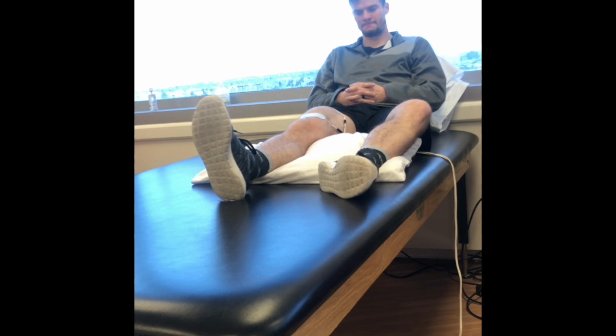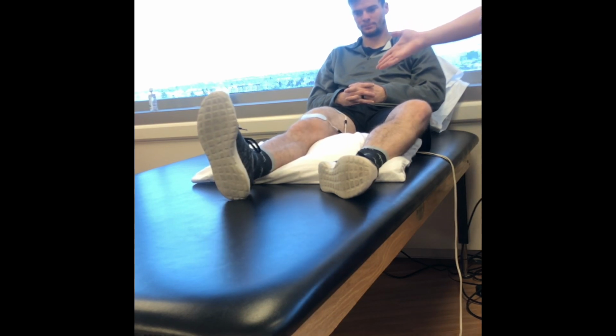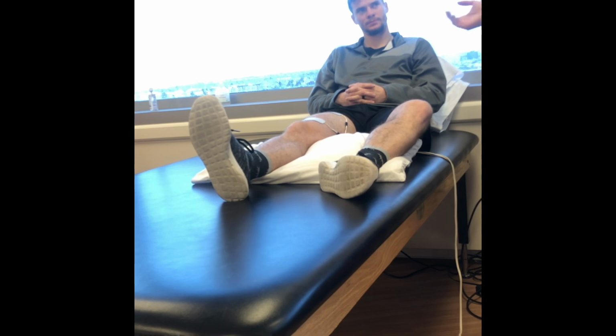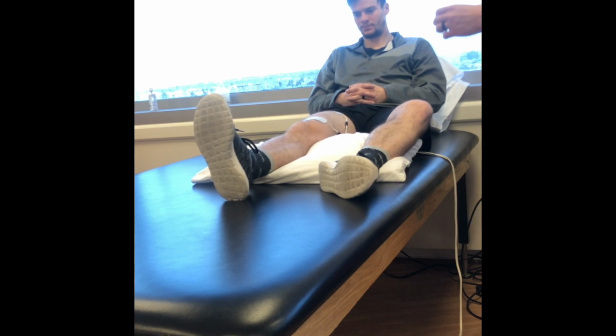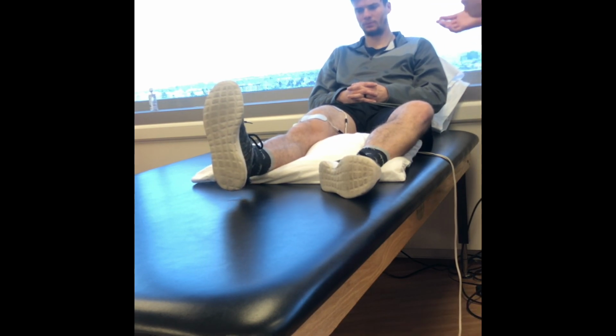Okay, we'll go ahead and start. So as you watch, you'll see right there, his leg is contracting pretty hard. It can, again, feel a little uncomfortable, but using the big pads really helps as well. So again, we're going to go for about 2 contractions, so we already got 1. So then here in a second, we're going to get another. And after that, we'll go ahead and pause the treatment. And as you do this, I want you to be flexing your quad as hard as you can along with it. So that way we're kind of retraining that muscle and teaching it how to work again.